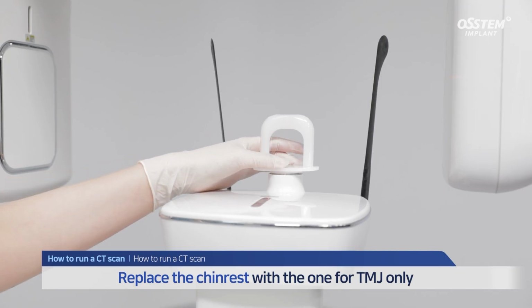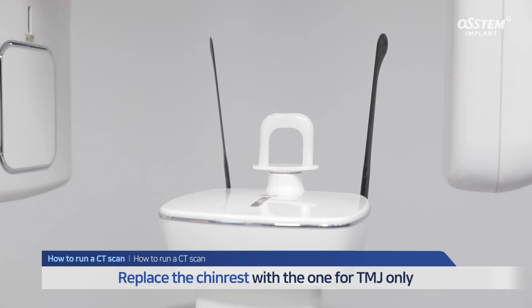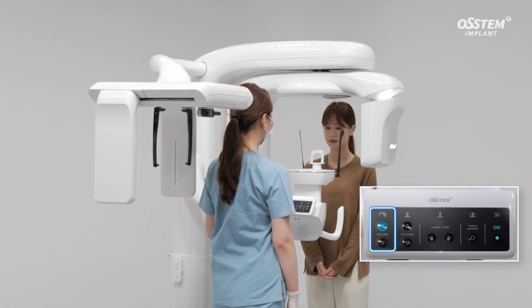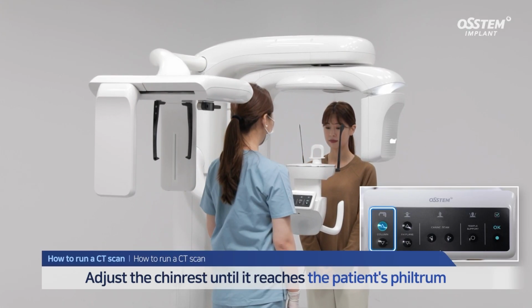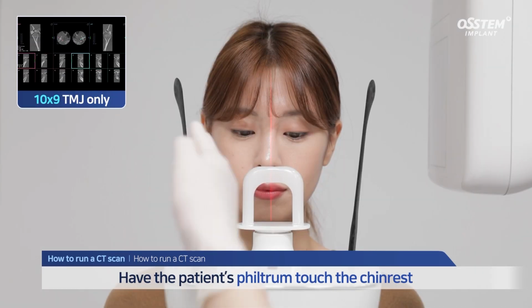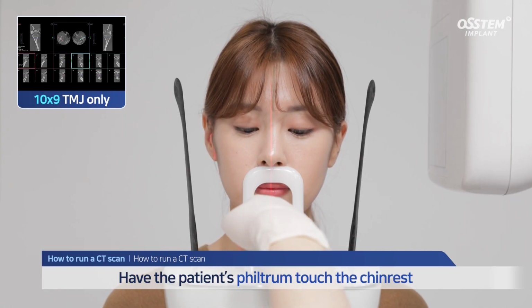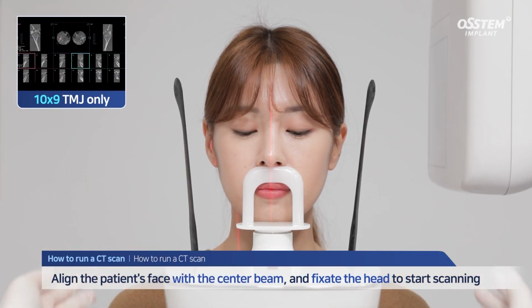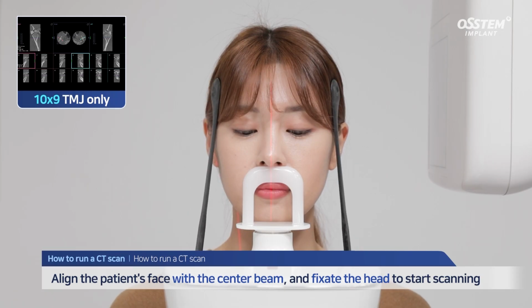Replace the chin rest with the one that is only used for TMJ. Adjust the height with the column up-down button so that the chin rest reaches the level of the patient's philtrum. Have the patient's philtrum touch the chin rest. Keep the center beam to the center of the patient's face. Then, fixate the head to start scanning.